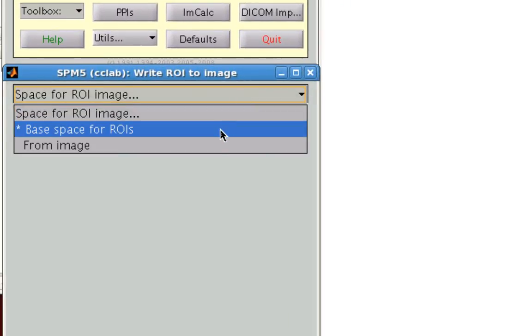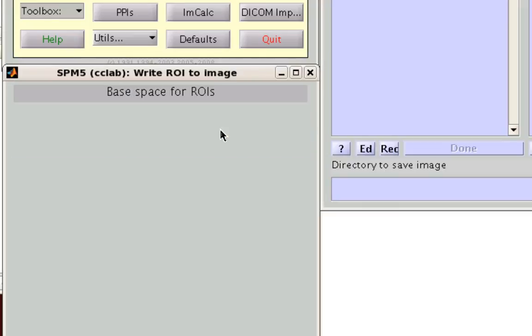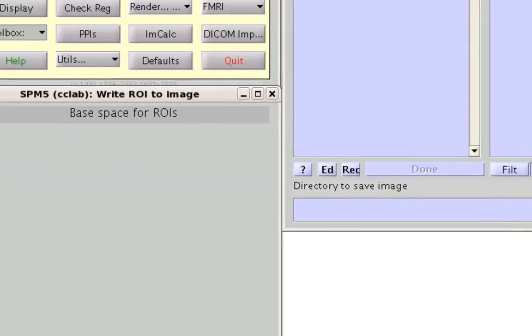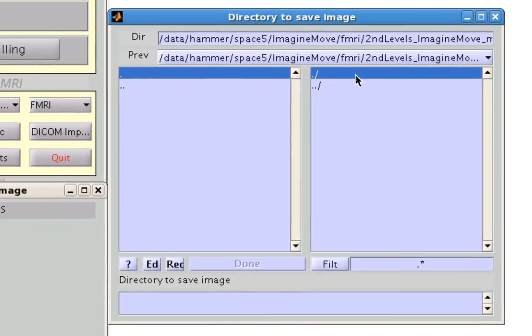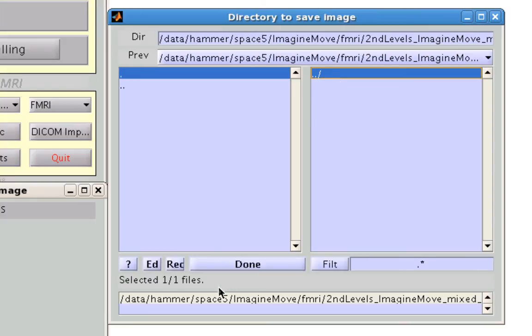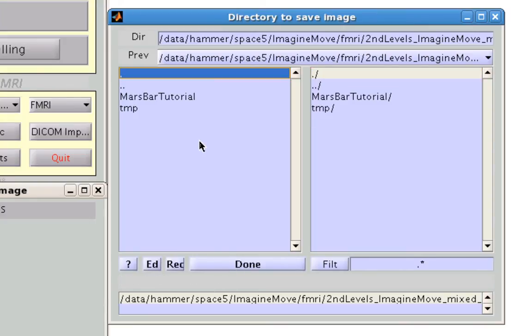For the space, usually the default of the base space for ROIs is fine. And for the directory to save the image, you can go ahead and click on this ./ to specify, save it to the current directory. Likewise, you can also navigate to other directories and save them in there as well.